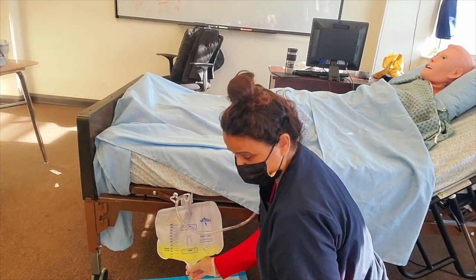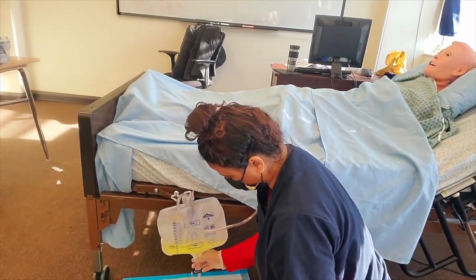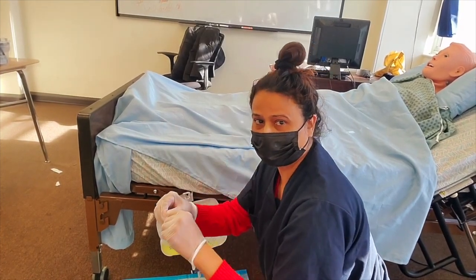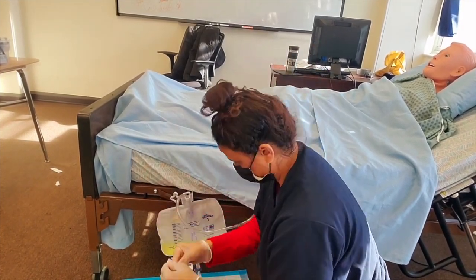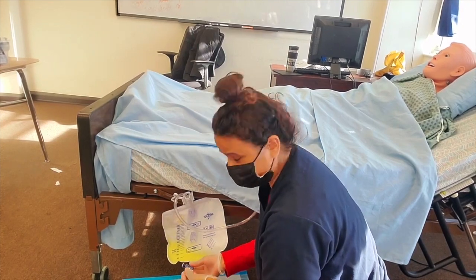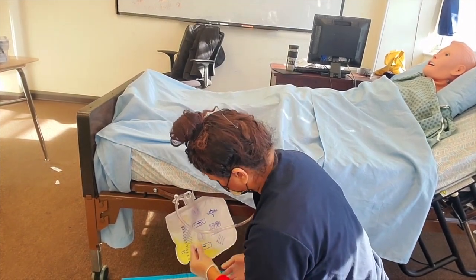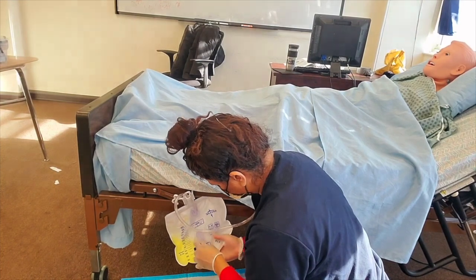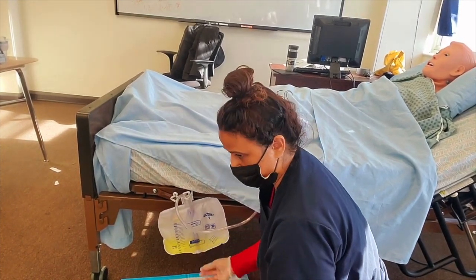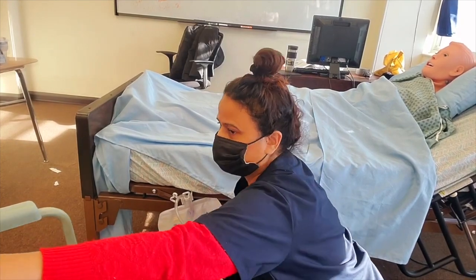We got Mrs. Jones's output. Now take your alcohol swab — this port is an entry for infection, so you clean that port, then you put it back. The next thing I want to do is measure it.